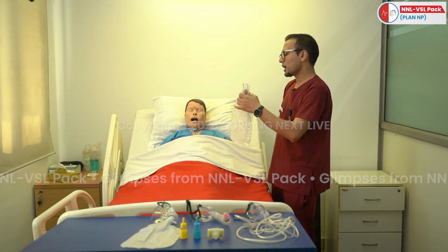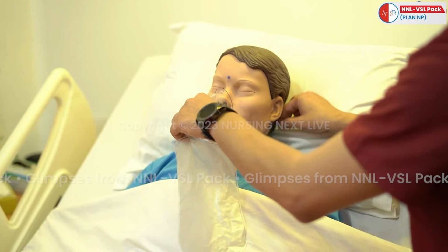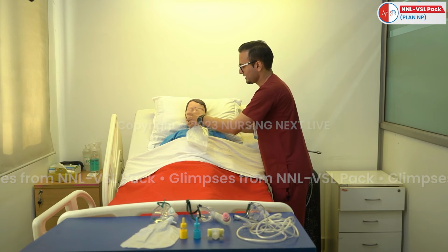Now I will show you how you can attach this mask over the patient. First, this mask will cover the nasal as well as the oral cavity of the patient.